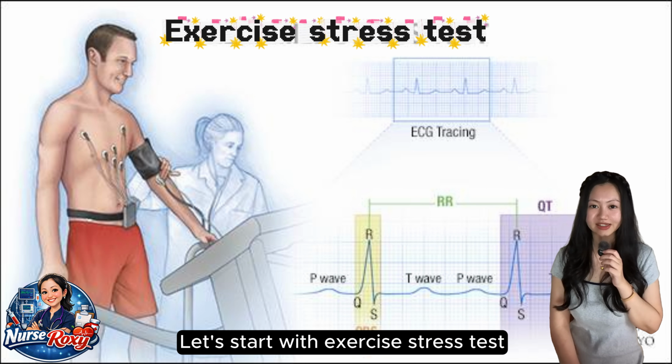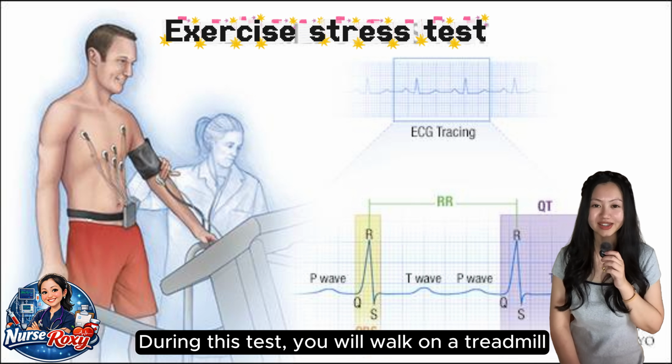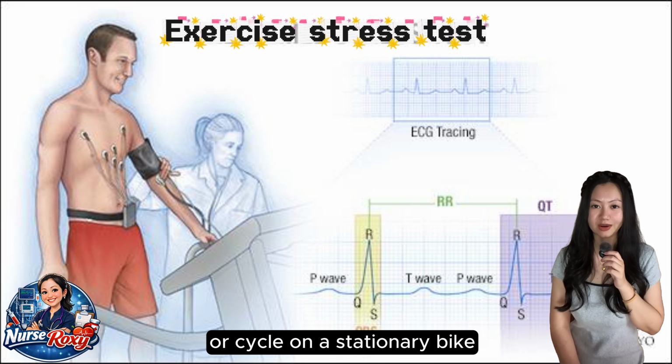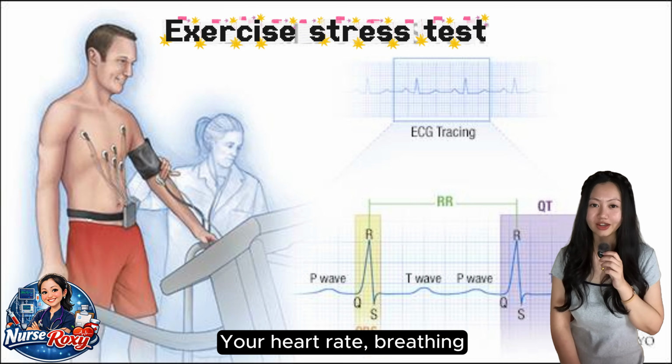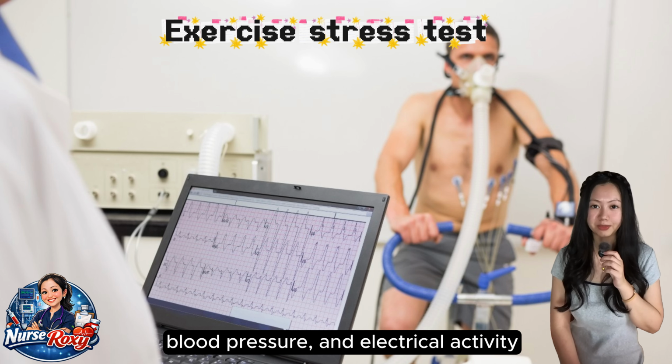Let's start with exercise stress test. During this test, you will walk on a treadmill or cycle on a stationary bike while your heart is closely monitored. Your heart rate, breathing, blood pressure, and electrical activity are recorded to evaluate how your heart responds to physical exertion.